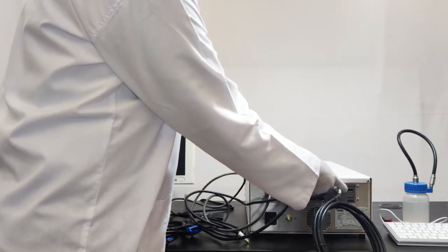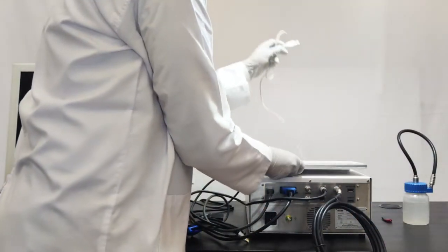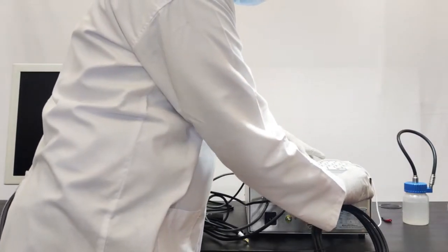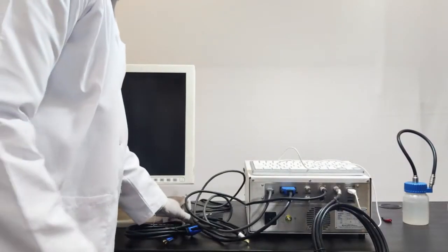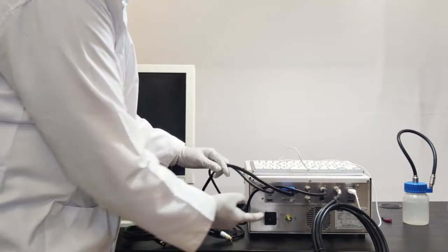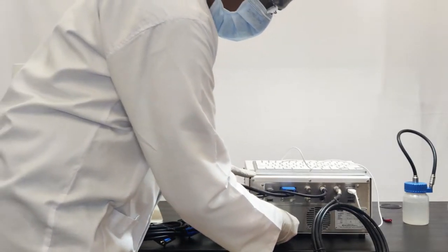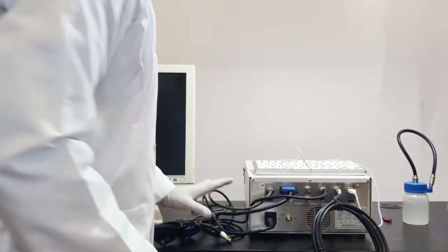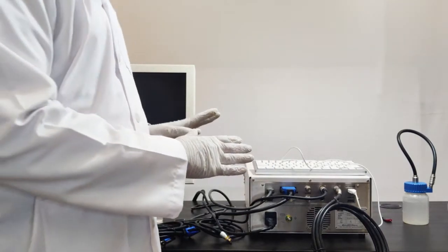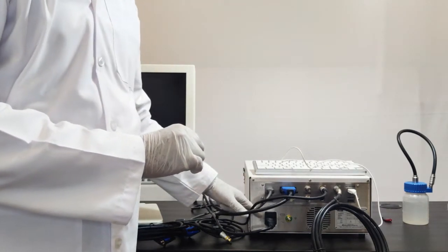There is a keyboard slot where you can connect the video processor keyboard. The most important part is the power supply cable. There is a power supply slot, and you connect the power supply cable here. This completes the connections for video output signals, the keyboard, and the power supply.